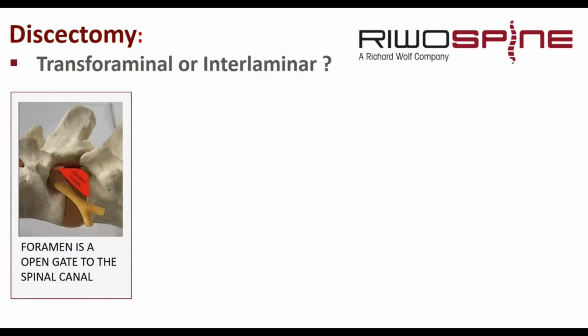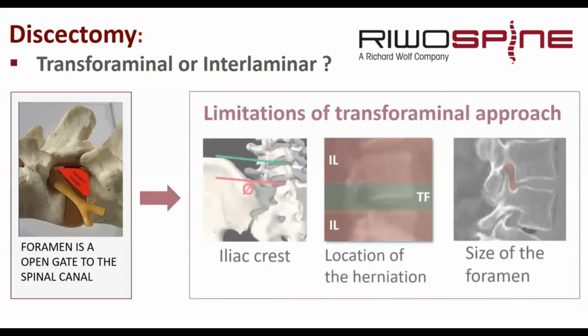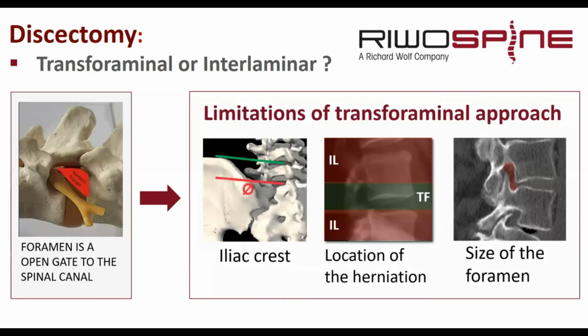For the discectomy, in our philosophy, we believe that, of course, the foraminal approach is the least invasive approach. It's an open gate to the spine. We would like to do the operation with the foraminal approach, but according to our philosophy, we have some restrictions. Maybe when you attend these kinds of symposiums or check the literature, you can see different tactics. All of them are done really successfully, but we can only share our experience with you right now.